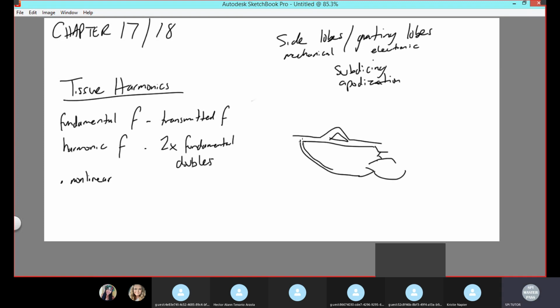So in this parasternal long axis of the heart, you have this tissue, and let's say that this is like slanted. You have this tissue right here. And let's imagine that this is my image right here. So this tissue is on the side, right? It's not perfectly down my center.